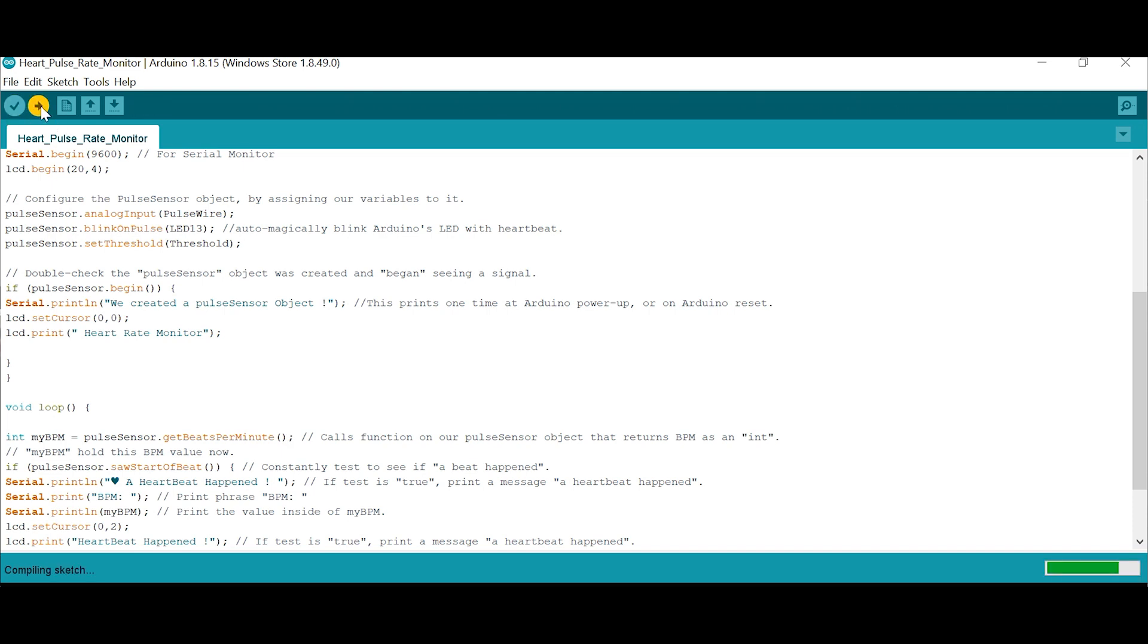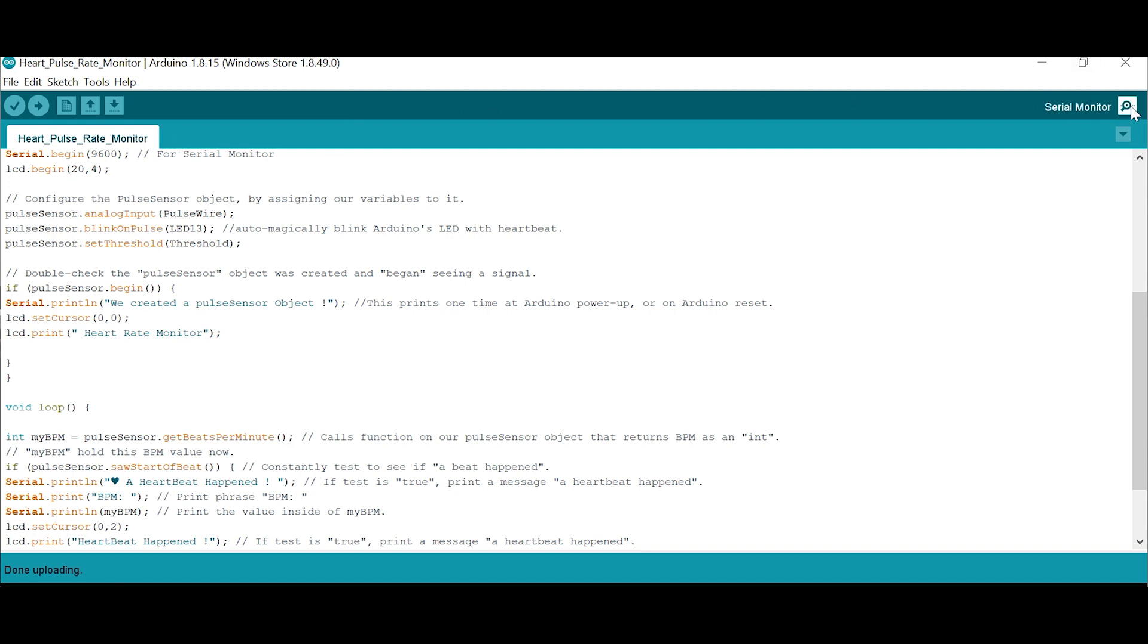You can verify the program compile only, or you can press this - it will compile as well as upload. Even if you press only this. Done compiling.